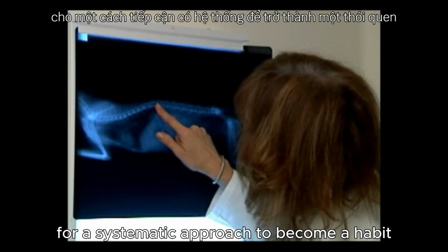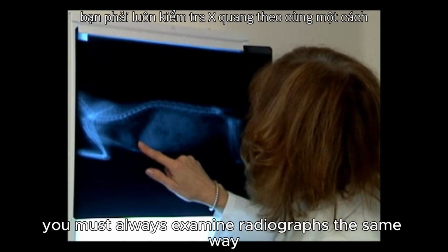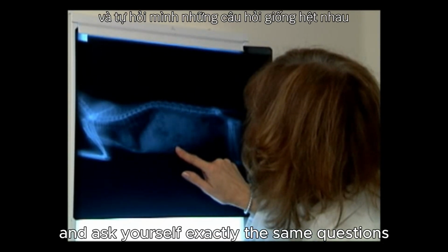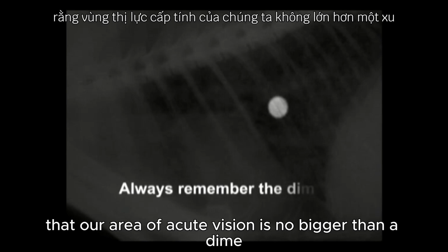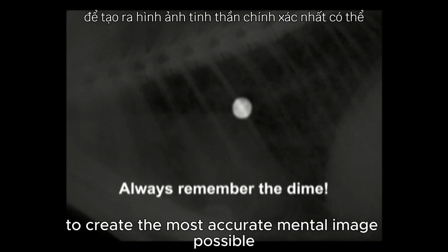For a systematic approach to become a habit, you must always examine radiographs the same way, look at the different structures exactly in the same order, and ask yourself exactly the same questions in the same order. And always remember that our area of acute vision is no bigger than a dime at 60 centimeters, so consciously select your visual area to create the most accurate mental image possible.